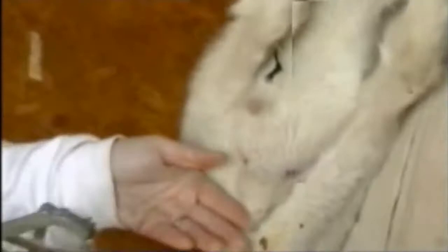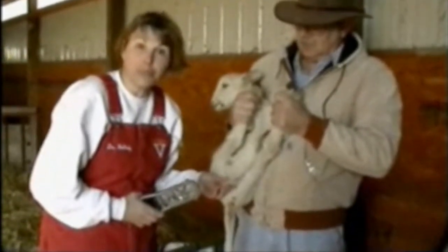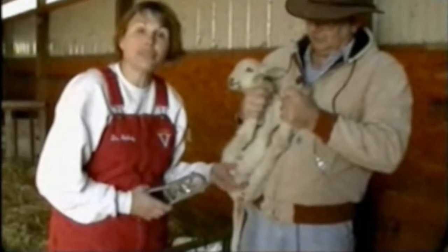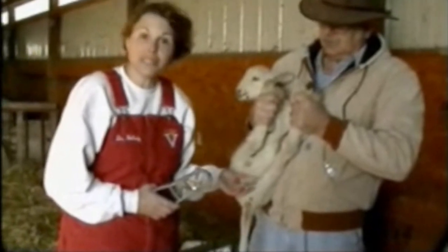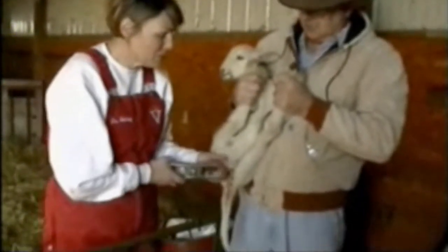The prongs go towards the lamb. The holder is the key to this because the lamb naturally sucks its testicles back up for protection. You have to be able to hold the lamb so that you can make sure that both testicles are down. It's very easy to band them and miss the testicles because the lamb had taken them back up into its body.